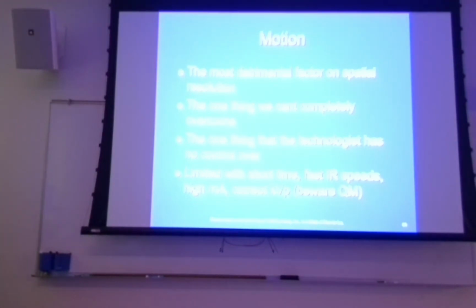Your mA is generally fixed during your exposure. There's specific types of generators, falling load generators, where your mA can change, but for most of your machines, the mA station is going to be fixed. So if you increase your kVp, time just decreases.